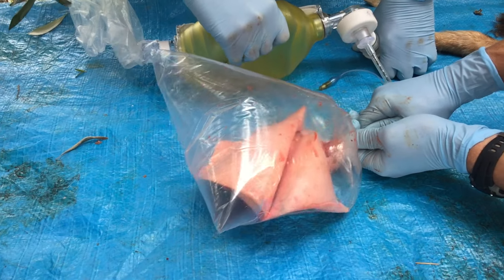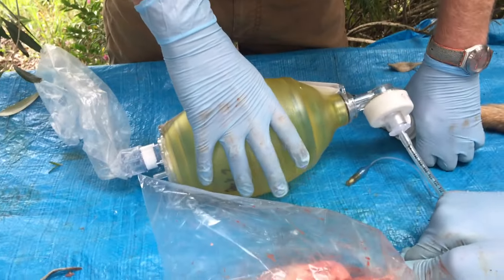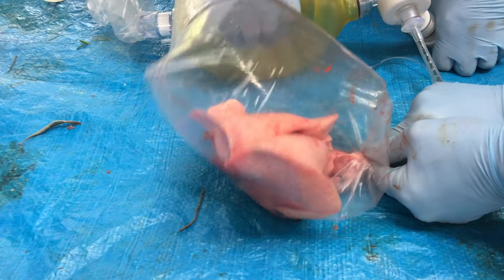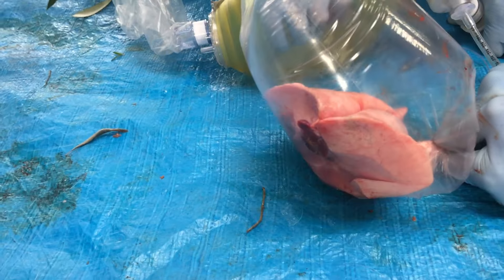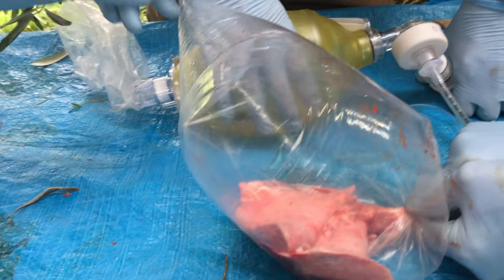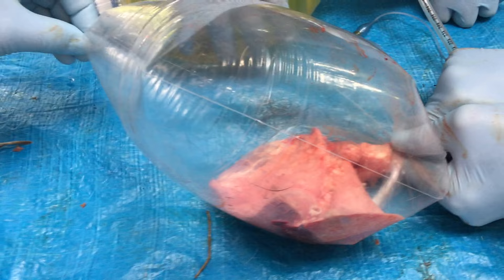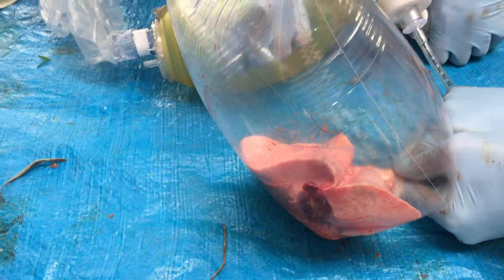Currently there's no pressure against the lungs that I'm feeling — it's just as easy as it has been. It's starting to get harder to bag it now. It's getting really hard to bag it now, and those lungs just are not inflating at all. So it's really tensioned.